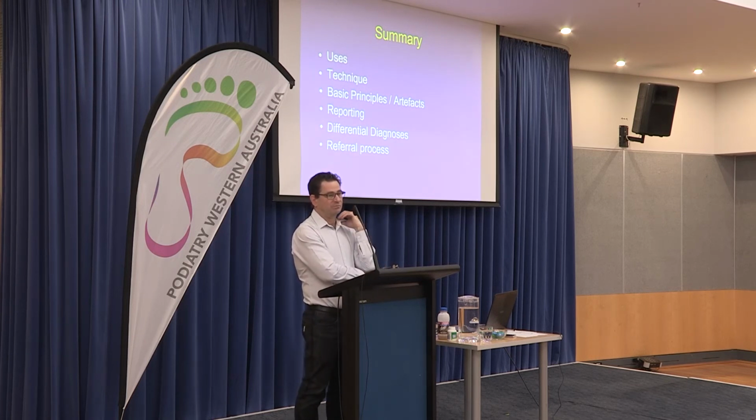If they do get all four foot pulses biphasic, I then use that as a lesson on how to keep the blood flow healthy, and talk about anti-smoking and cholesterol management. So I'm using that visual to get them engaged to keep them healthy, as opposed to looking for disease. I thought it was quite interesting that you're doing the same thing.